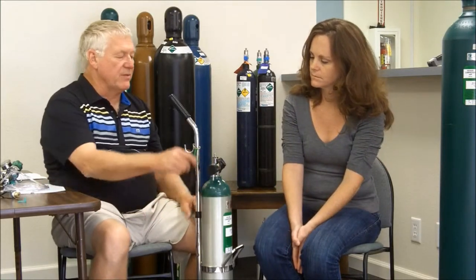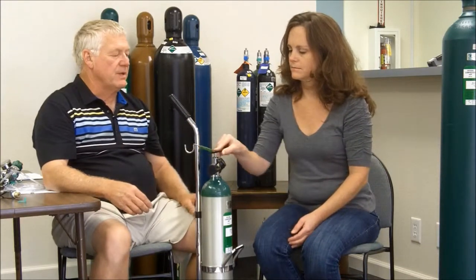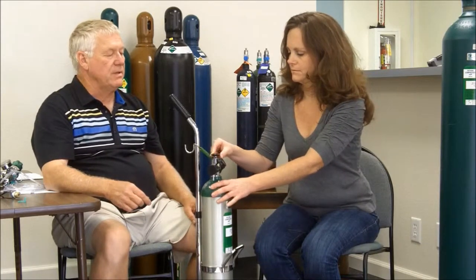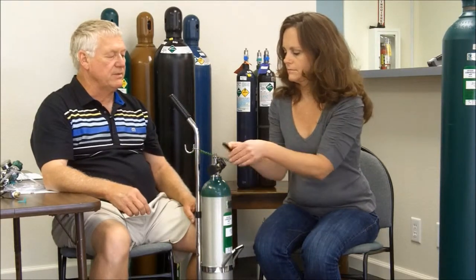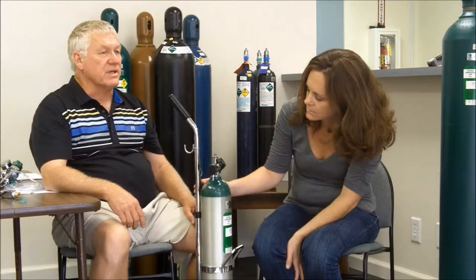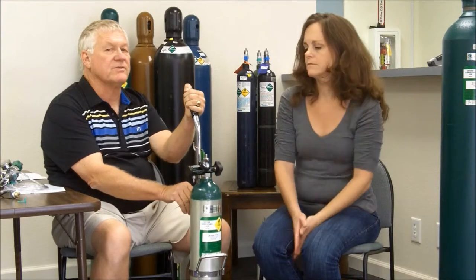In the off position, you then take the wrench and place the slotted end of the wrench on the top of the cylinder, and open it by pushing it away from you — counter-clockwise — and give it a good turn. You should then look at the gauge; that's the contents gauge. It should be all the way in the 12 o'clock position. The 12 o'clock position tells you the cylinder is full.